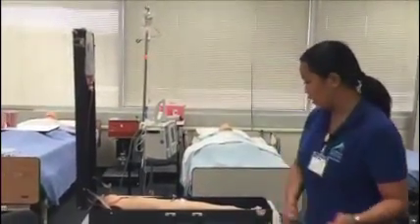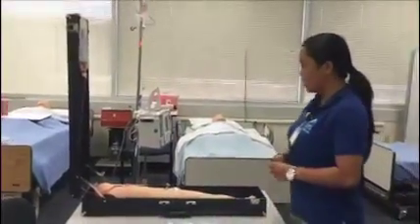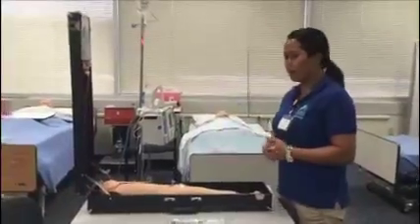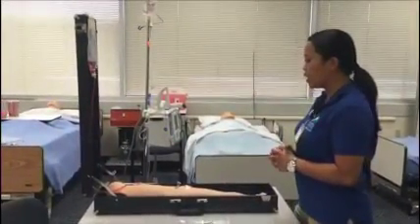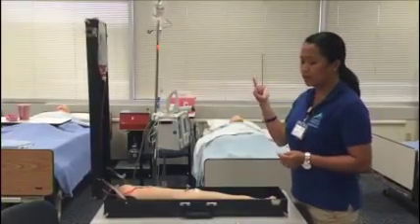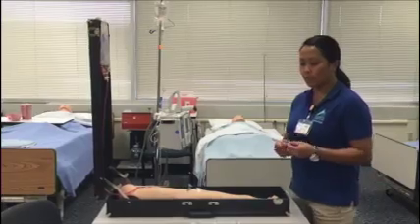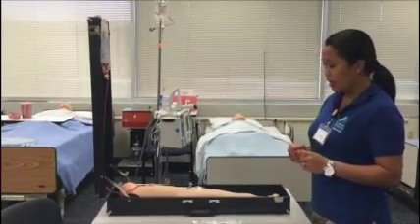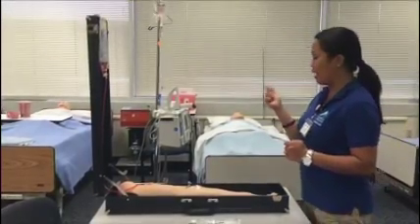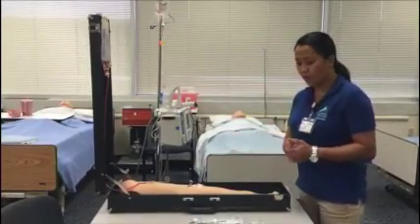All right, I'm going into the patient's room, and I knock on the door. Hi, sir. I introduce myself. My name is Riza. I'm going to be your nurse today. The doctor has ordered another piggyback line on another IV for you, and we have to mix it with the antibiotic Zosyn, and I have to put it in your IV site.